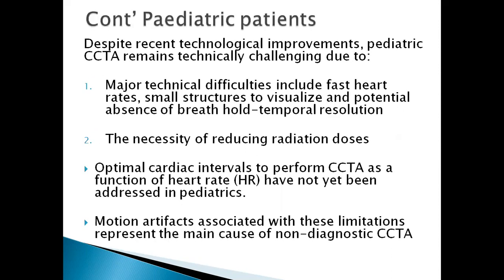And then looking at children themselves, I mentioned a little bit about children in the previous slides. Mostly children do not undergo cardiac CT angiography. Why? Because of some major technical difficulties that are associated with children.